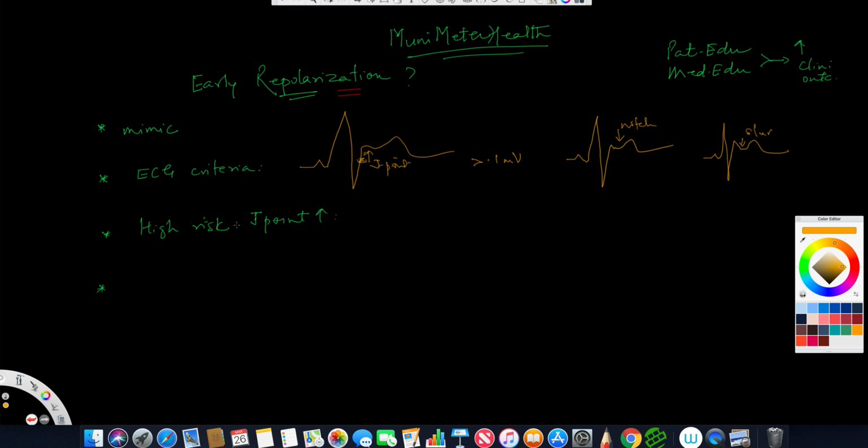Now, very importantly, this mimics certain clinical conditions. Why is it important? These patients are presenting to the emergency rooms or to clinics where a routine EKG is being done. Patients may present asymptomatically, but many times they may have symptoms. So the early repolarization patterns we've just seen on these EKGs will mimic something like a myocardial infarction, a ventricular aneurysm, or even pericarditis. And remember, each of these conditions is highly symptomatic, and they have morbidity and mortality attached. So these are very clinically significant conditions.